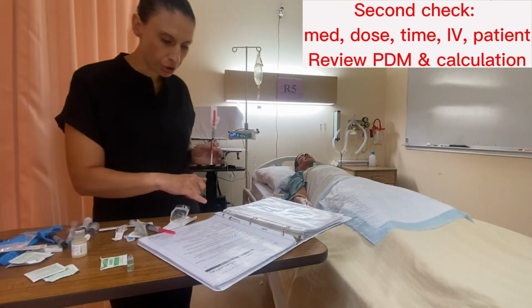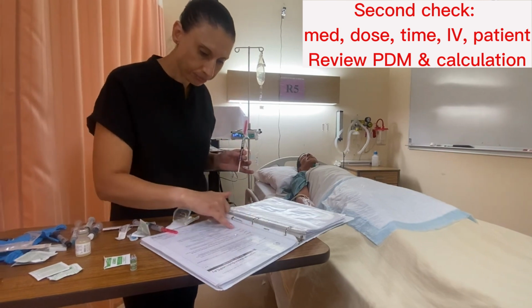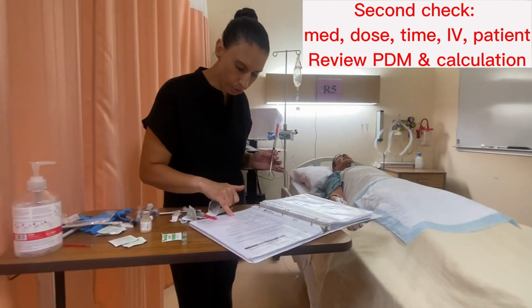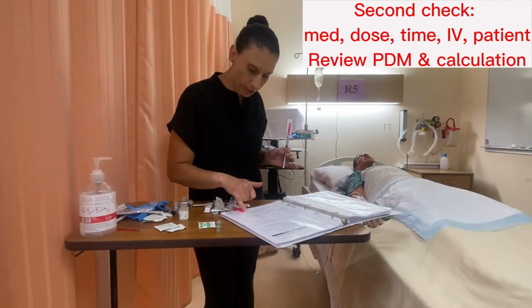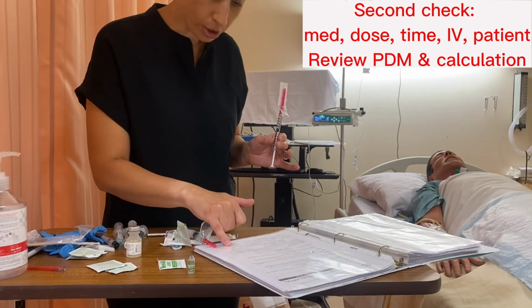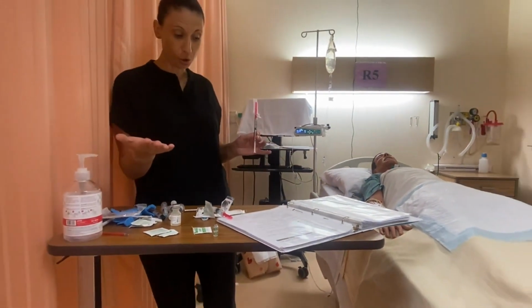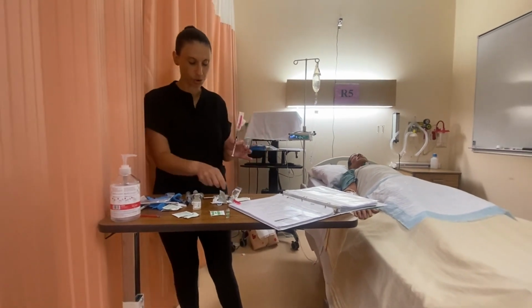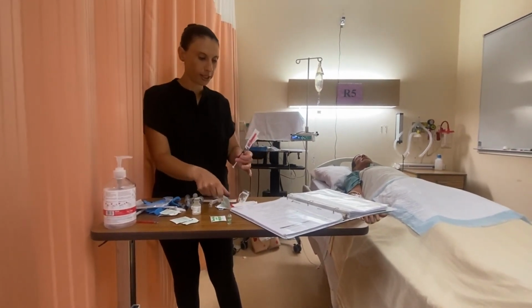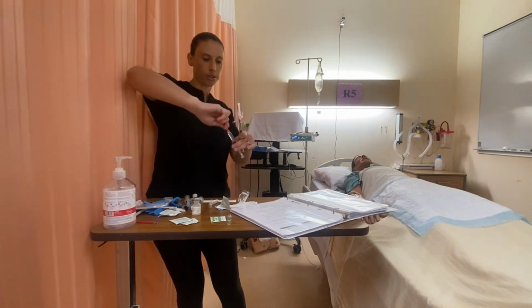I will also just double check my PDM, make sure I read it correctly, that it is morphine, and that I am giving it IV push. Okay, and I've checked to make sure that I can mix it with sterile water or normal saline. Okay, and I can do either undiluted or diluted. Okay, and I chose to dilute it. Okay, so next what we're going to do is we're going to take off this blunt fill needle.